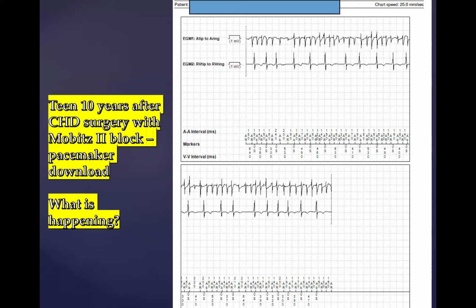So what would you then do about a patient like this? You've never seen AFib in this patient before. Do you want to know anything else about this patient? What are your concerns? Patient wasn't bothered by it. So what are your concerns about this rhythm? Your concern with that rhythm is if they're in it for an extended period of time, for thrombus formation.